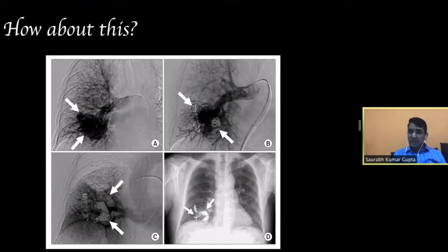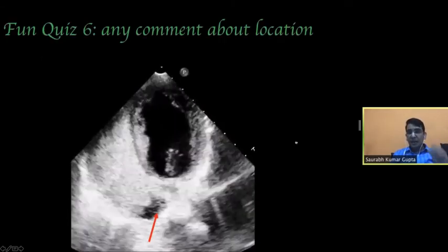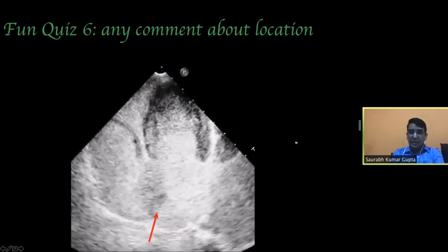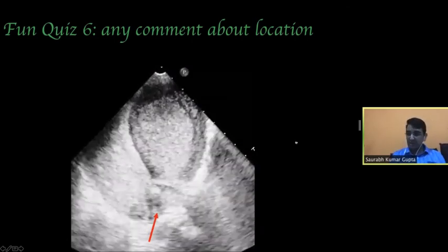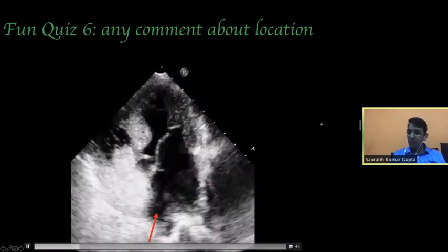How about this? This is surely a pulmonary AV fistula, but with so much dense filling that you have used almost a dozen coils to block this, and still there seems to be some filling of the arteriovenous malformation. Do you think that it will not cause a shunt which is torrential? So all these questions we'll answer, but before that, let me share with you what more can be deciphered from a saline contrast echocardiography of a patient with pulmonary AV fistula.